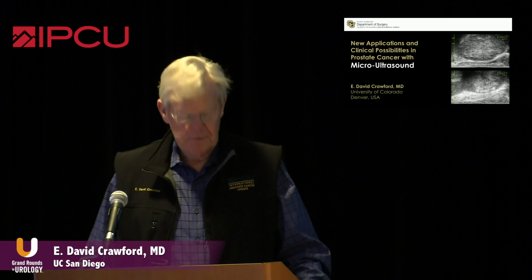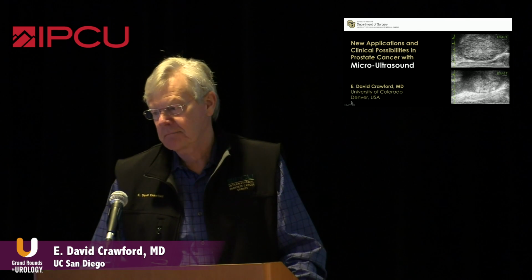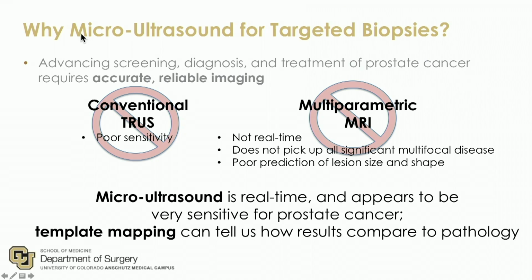My talk is basically about some of the other clinical possibilities of prostate micro-ultrasound and what we learned. The previous speakers have clearly outlined the challenges with conventional TRUS, with poor sensitivity. Multiparametric MRI is good, but it's not real time. It does not pick up all significant lesions. It picks up most of them, particularly multifocal disease. And there are plenty of descriptions about the poor prediction of lesion size.